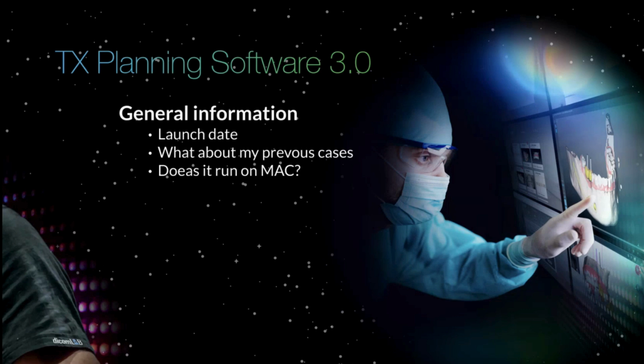With the launch date, what you will see now is that when you open your previous cases, they will still open in the old version of the software, which is a downloadable software on your computer. All the cases you upload to this platform since Monday midnight will open in the new software version, which I will present to you soon.